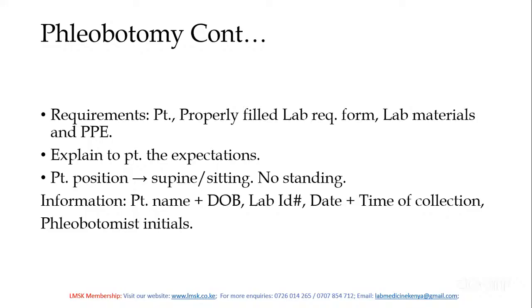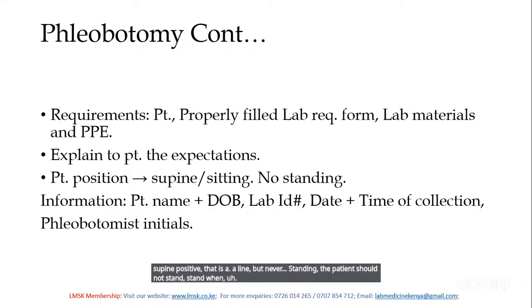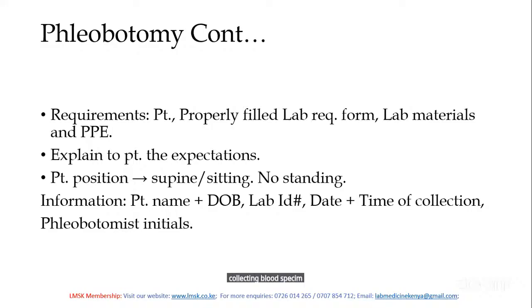Then you position the patient either in a sitting position or supine position, that is lying, but never standing. The patient should not stand when collecting a blood specimen.